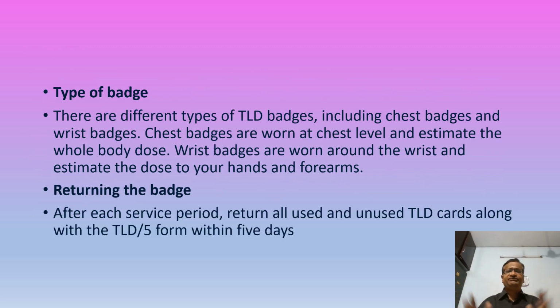There are different types of badges. We can have chest badges. We can have wrist badges also. Yes, they should be returned and detected every 3 months according to the protocol of the institution.